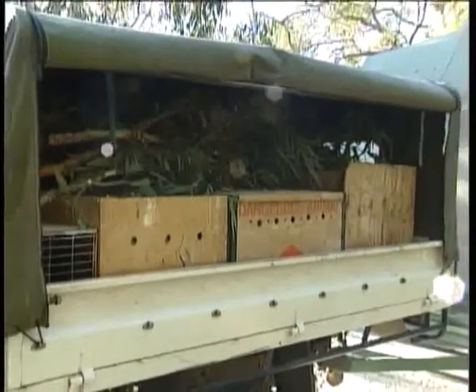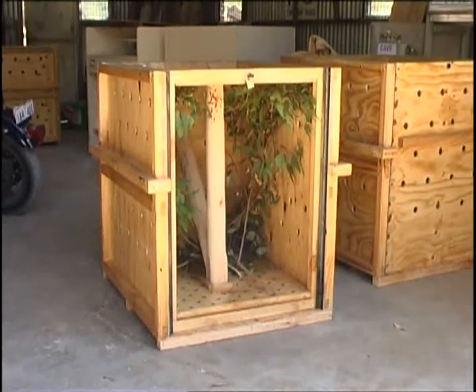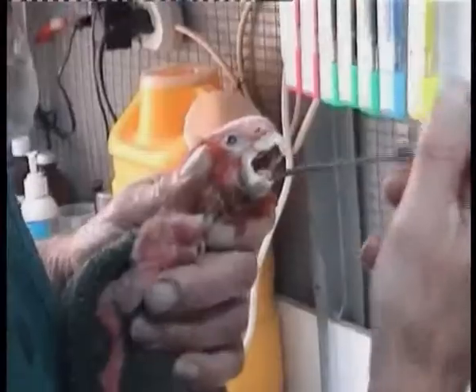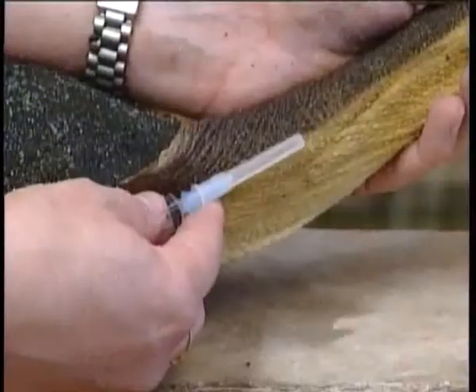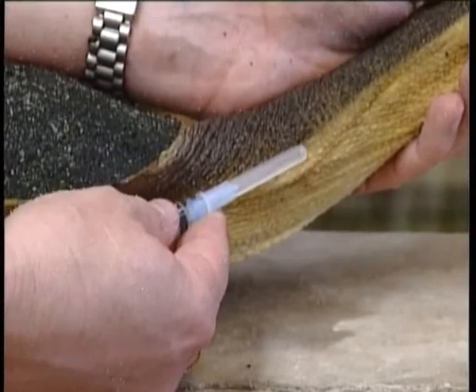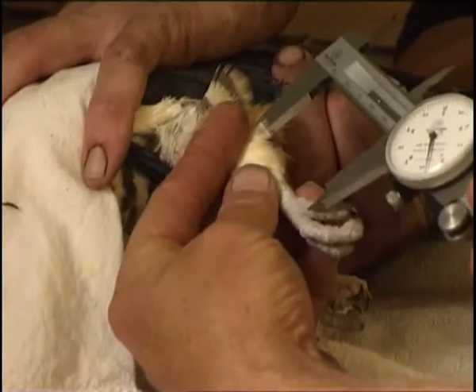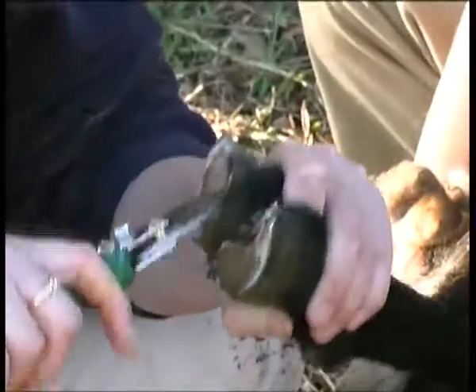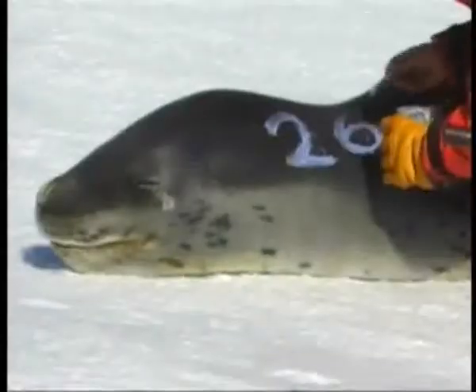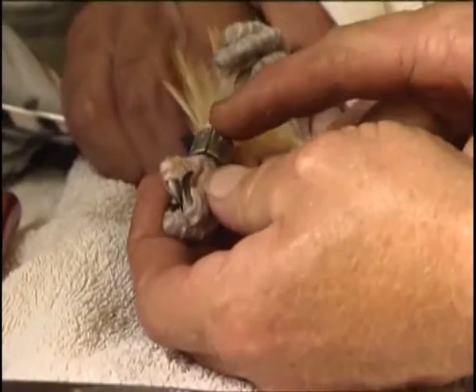Transport equipment and methods will also be covered. Some of the procedures to be covered are tube, crop or force feeding, blood collection and injection sites, physical examination, measuring and weighing, maintenance procedures such as wing, beak, nail and claw clipping, and identification methods including microchipping, banding and tagging.